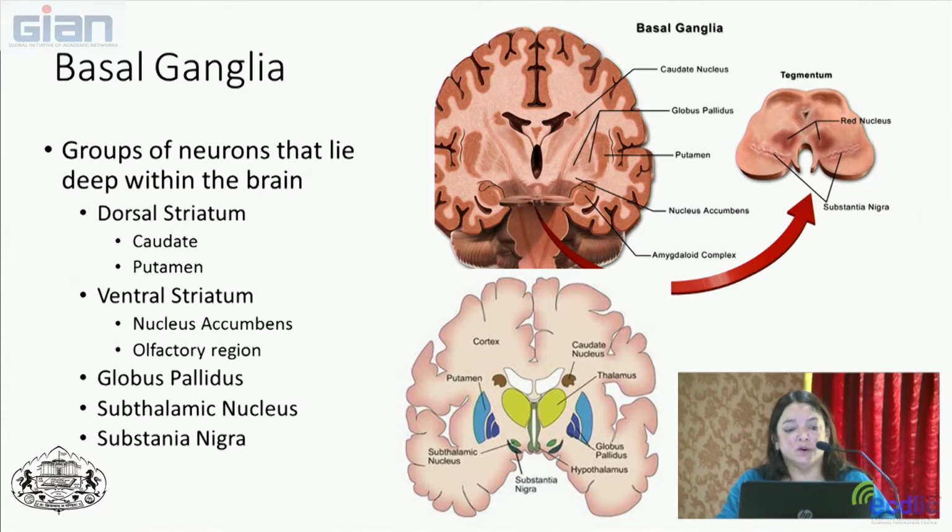These regions are important because they're involved in the reward system of the brain. We often do fMRI tasks that involve winning and losing, to look at the reward systems, and these systems really light up the caudate and the putamen, especially the caudate. So if we have a person that's winning money or thinking that they're winning money, this area of the brain lights up quite well.